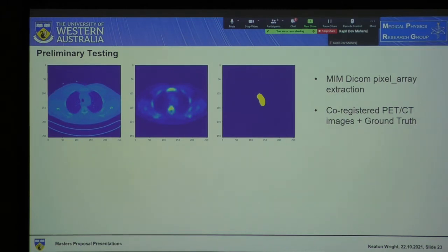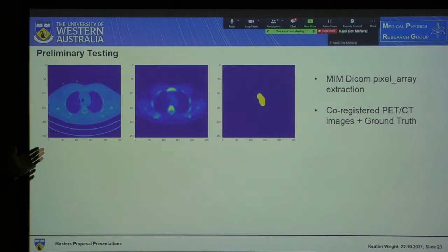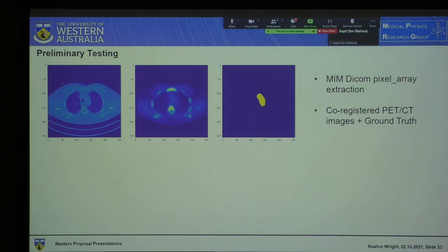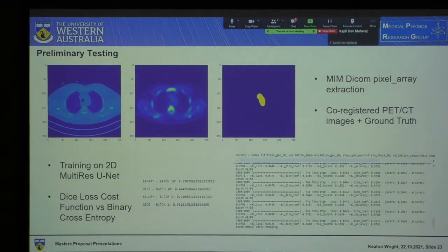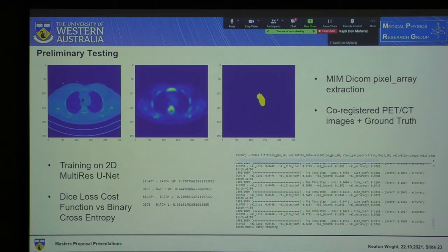I've been working on this for a little while. The majority of my time has been spent extracting the data from MIM. As we can see here, for a given Z value, we have a CT image, the corresponding PET, and then the ground truth — in this case corresponding to the aortic arch. A lot of time was spent getting that off MIM and onto the computer to plug into the model. This was preliminary testing done on 2D multi-res UNET, and we achieved a DICE score of around 0.45 on the validation set — not great, but a reasonable start to work from.